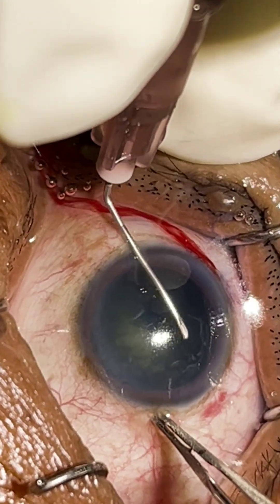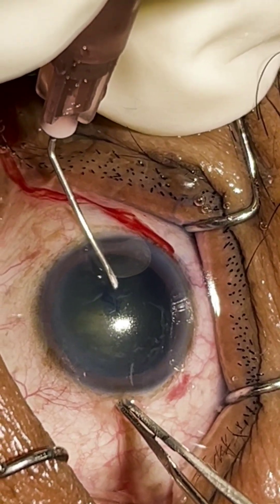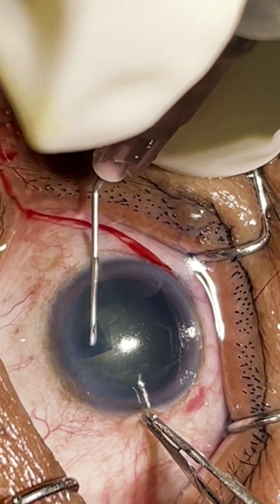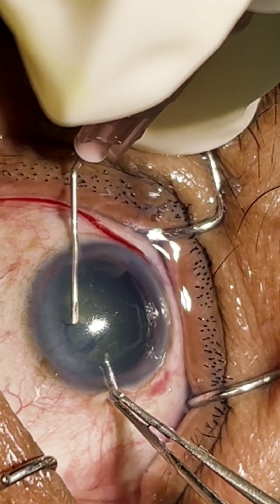In an immature case, the rhexis is tough because there is a high chance of extension of the rhexis to the periphery. So ideally we should do a 5mm size of rhexis, not larger or smaller.